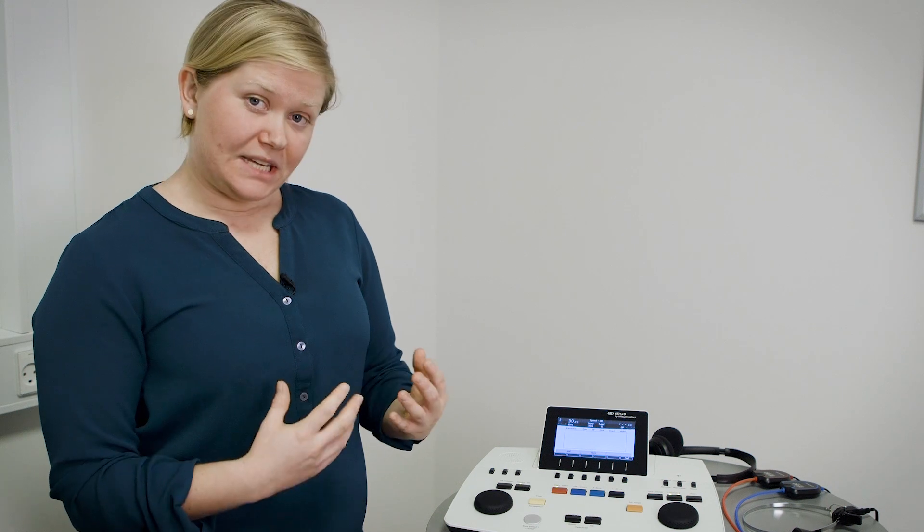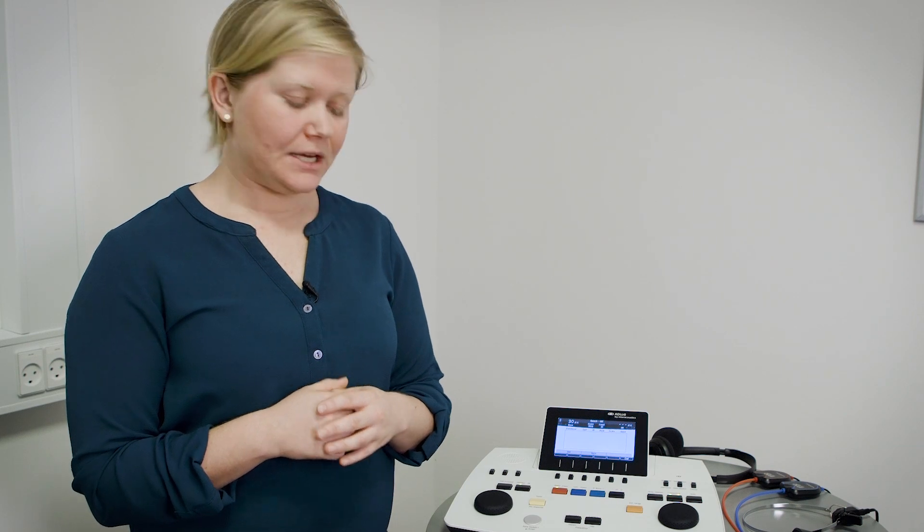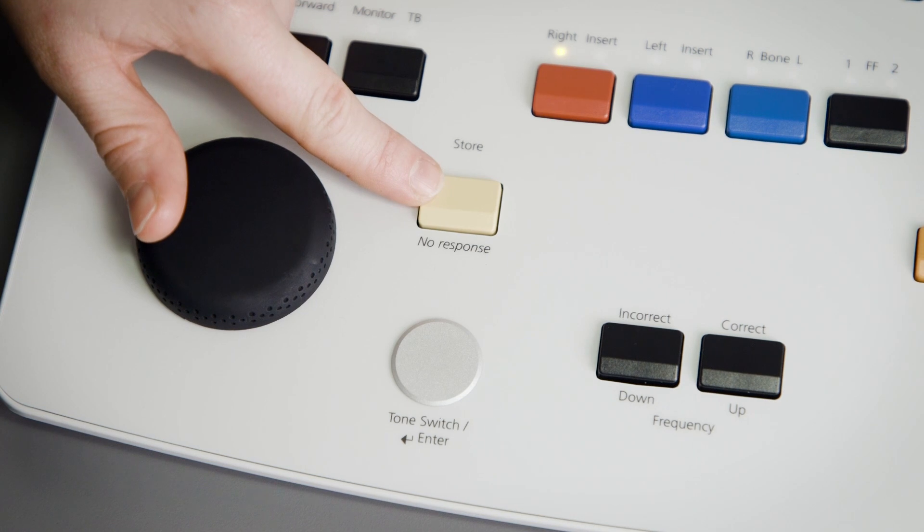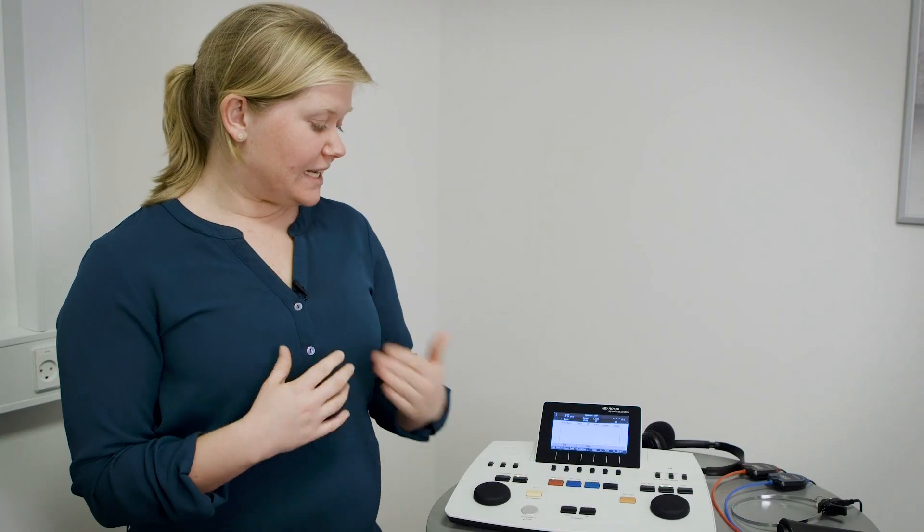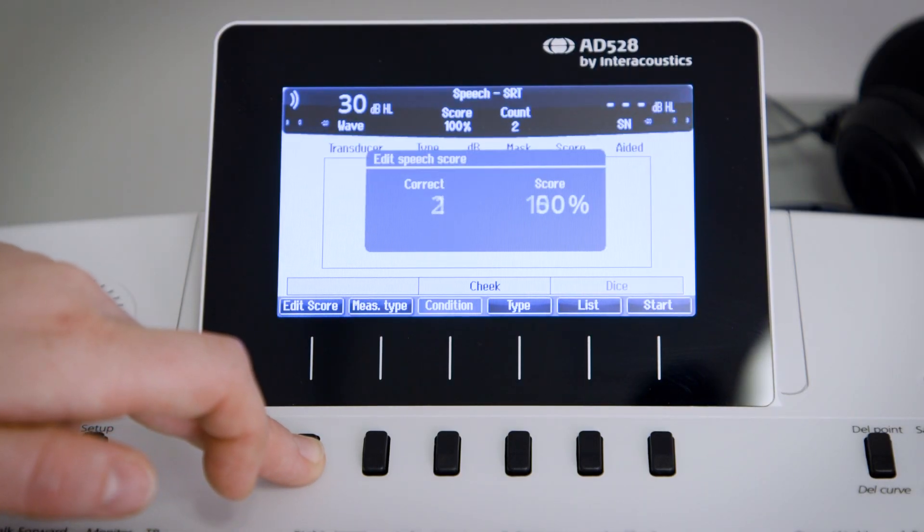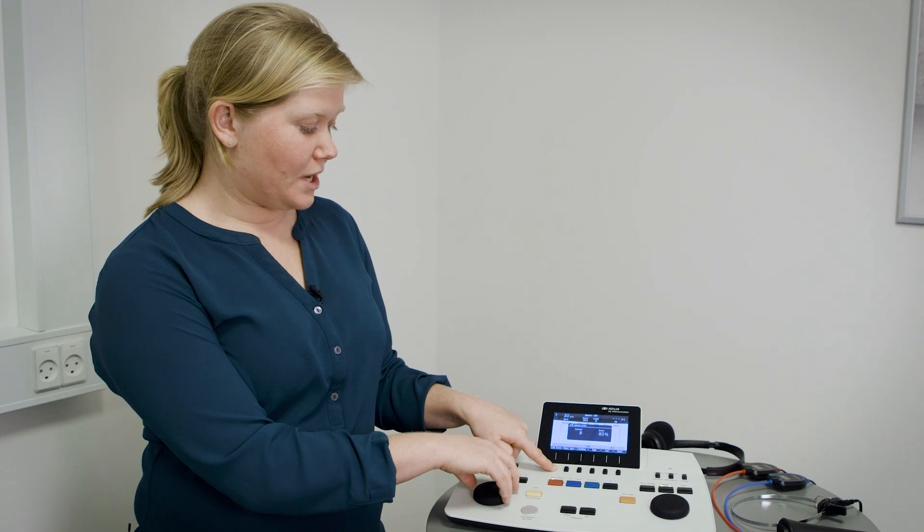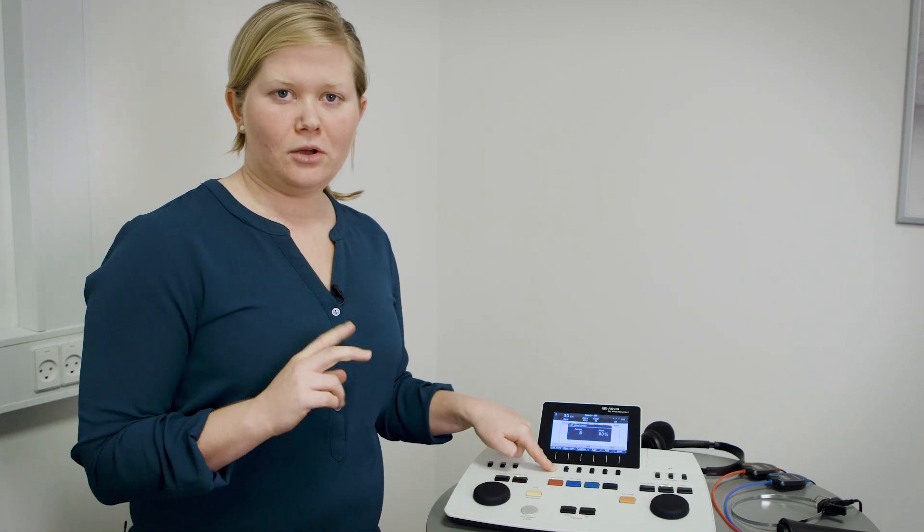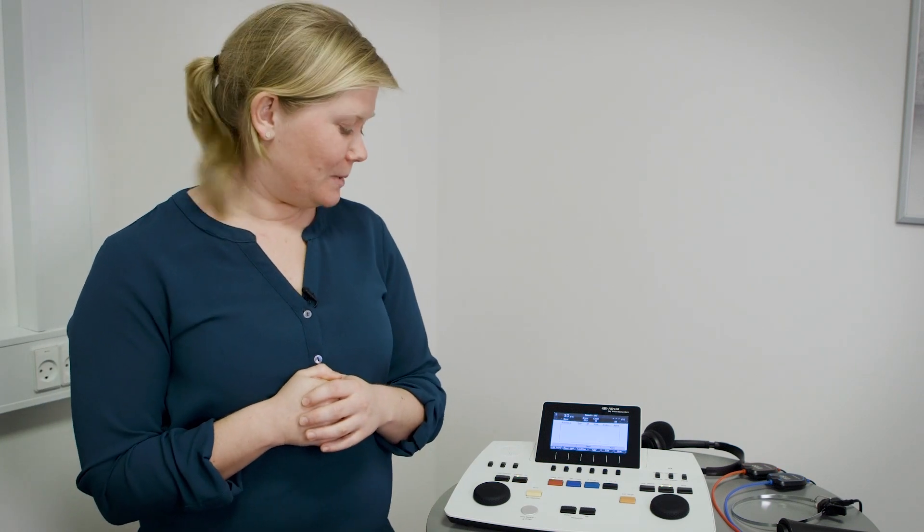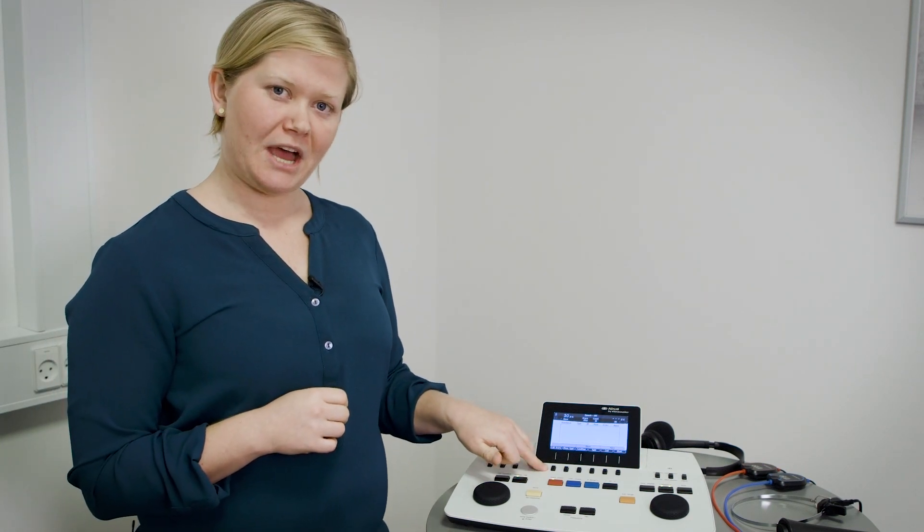That is what we do during the test to collect our results. When the result is finalized we want to store the results, which is done up here. In case something was obtained incorrectly or there's something we need to edit for the score, we have the opportunity to edit the score here so that you can change the score in case you press correct or incorrect in the wrong way. So that is available as the first function key that we have.